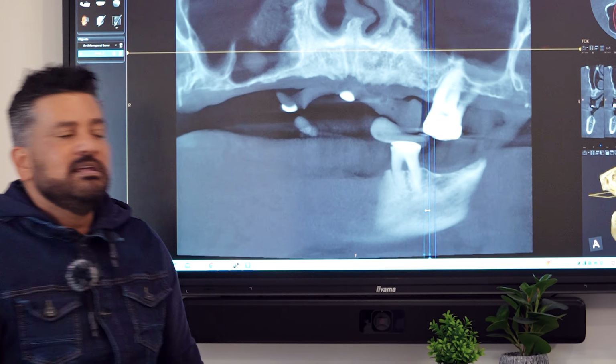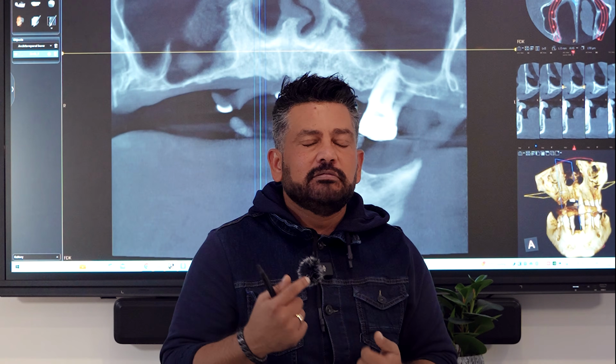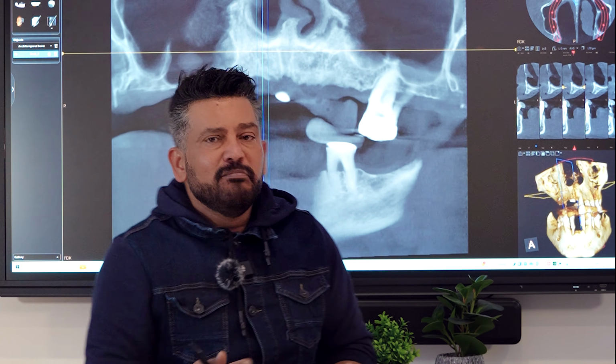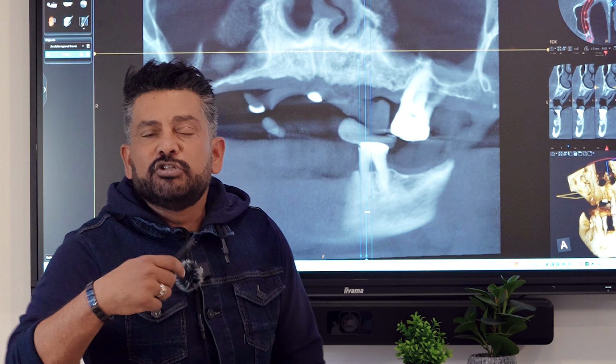This is the whole reason that we do things the way we do things in 21D, because when we come to the surgical stage, we want it to be a one-off event, almost always. With this level of planning, it's even rarer than it was when I was doing it in my previous incarnation, when I was working at Evo Dental, because there I didn't have the technology I have available today to produce the guides I can produce today. So when I developed the Evo solution over there, we had to almost what we call eyeball it. And eyeballing is never the level of accuracy that you're going to get with this detail of planning, and then the ability to produce surgical guides from this.